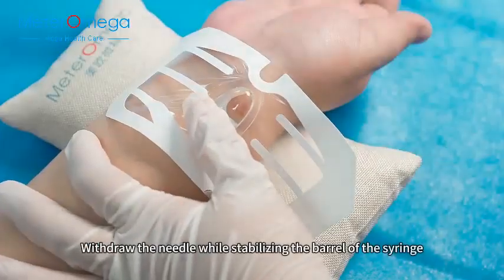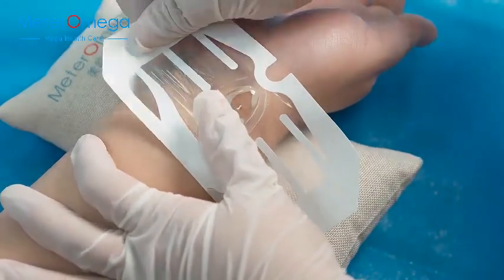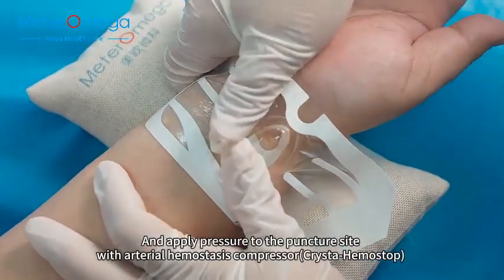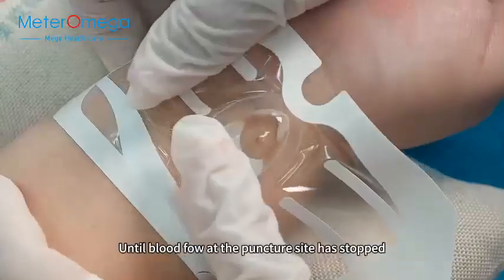Withdraw the needle while stabilizing the barrel of the syringe and apply pressure to the puncture site with arterial hemostasis compressor (Crysta-Hemostop), until blood flow at the puncture site has stopped.